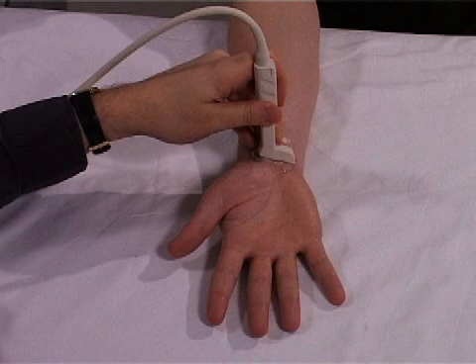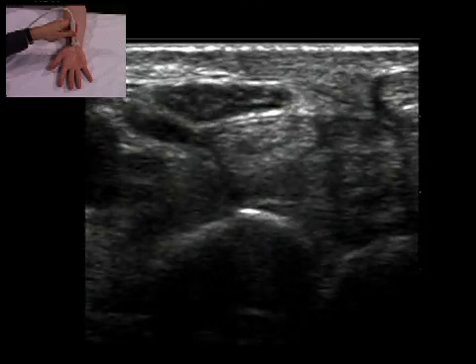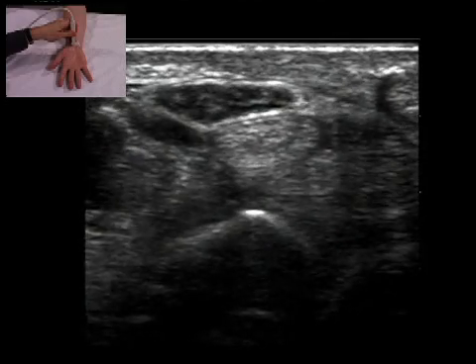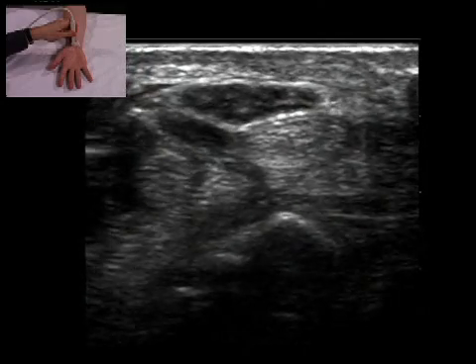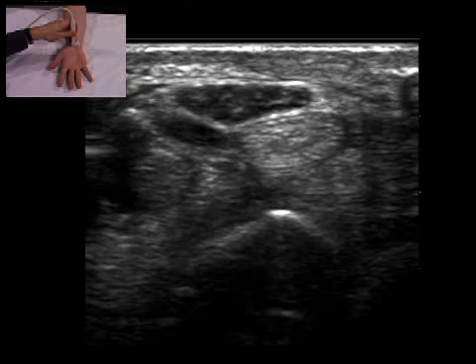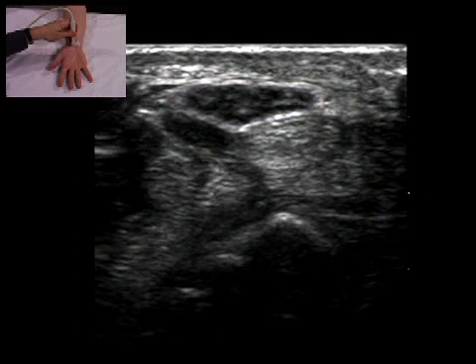The patient sits with the hand supinated and arm supported. The probe is placed transversely over the distal end of the radius and moved one to two centimeters distally. The median nerve appears hypoechoic with a hyperechoic rim.